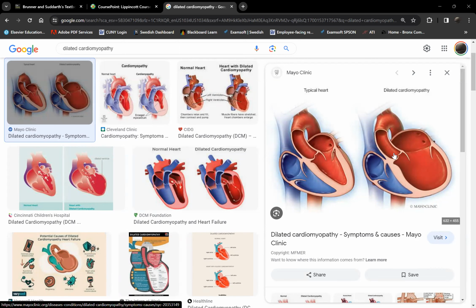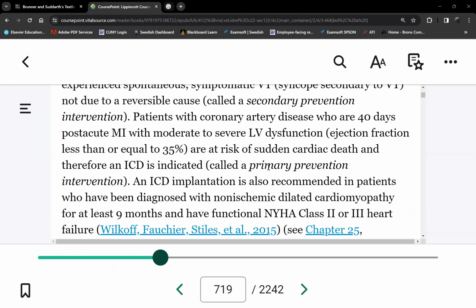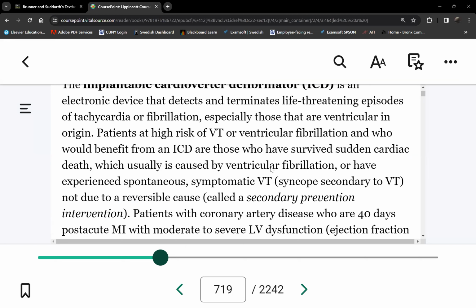So they need ICDs. Other indications as listed here: those who survived, meaning you had a cardiac arrest, so we performed chest compressions on you, somehow we got you back, they will be recommended to have an ICD. Because if they survived VFib or VTAC, can they have another one in the future? And will they be in the hospital during that time? Probably not. Okay, they'll be out somewhere partying or wherever that next episode may be.